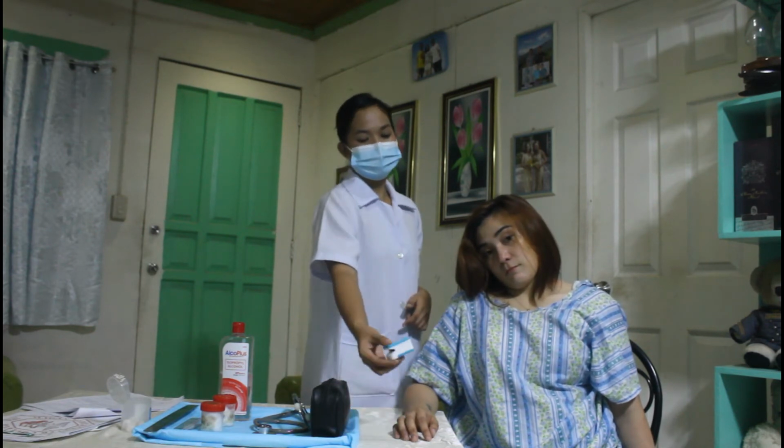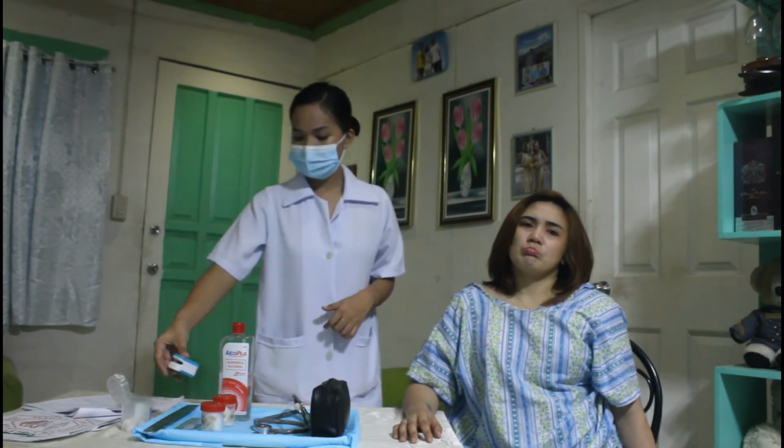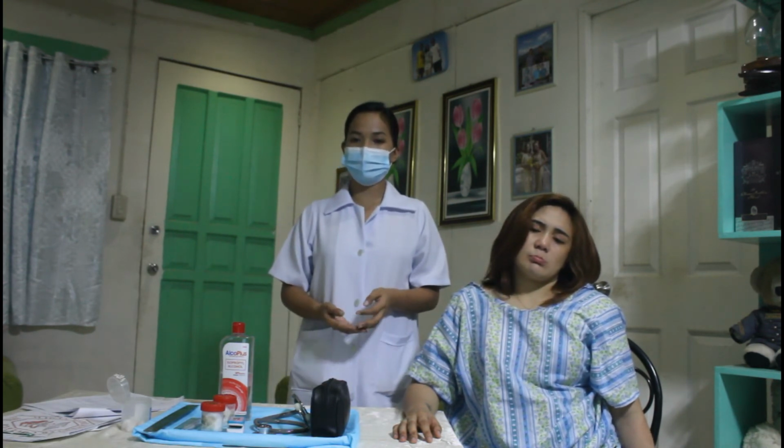So store the probe in appropriate location. So sensor probe tension and sensitivity to disposable sensor probe adhesive can cause skin irritation and lead to disruption of skin integrity.